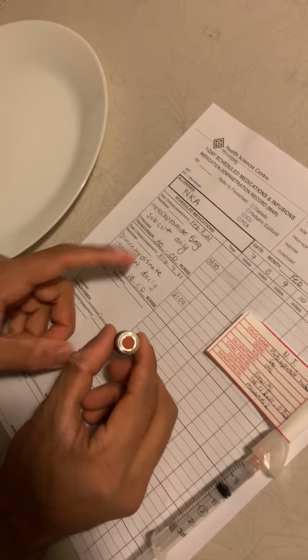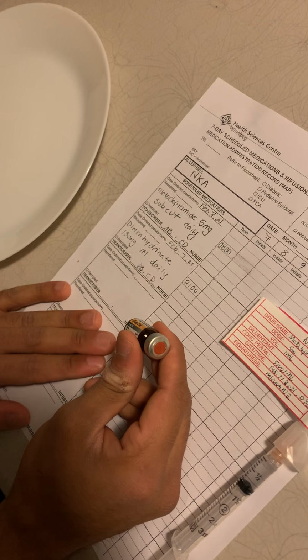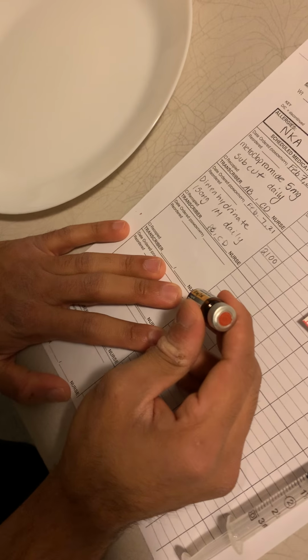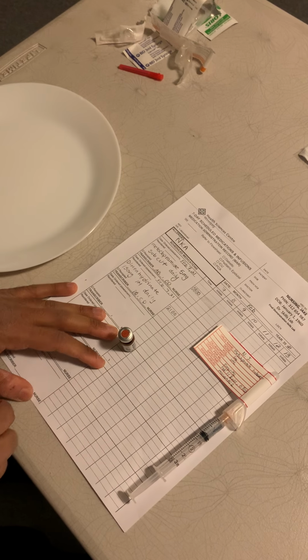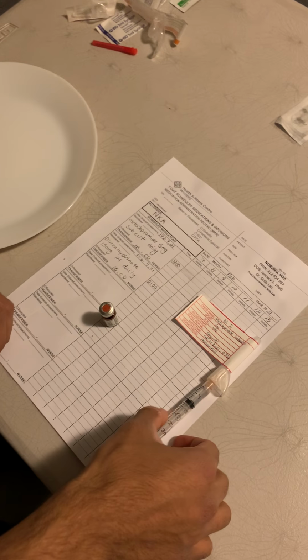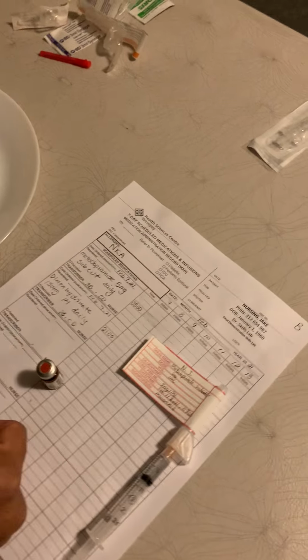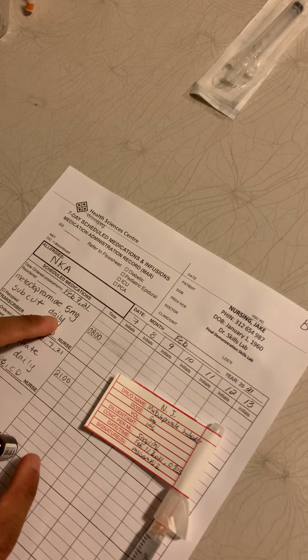And this medication was subcutaneous. This vial did come in an IM/IV route vial, so I did get clarification from the pharmacy and the parenteral drug monograph that I can administer this medication subcutaneously. And this medication also has a subcutaneous needle gauge and size on there, so that's appropriate. And then the time frequency of medication is once daily at 0800.